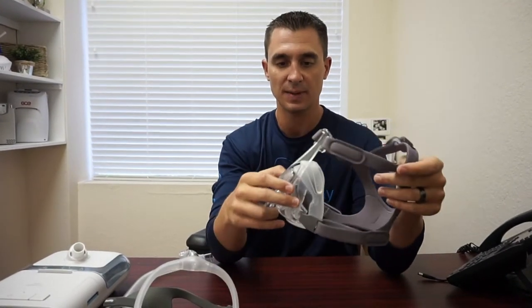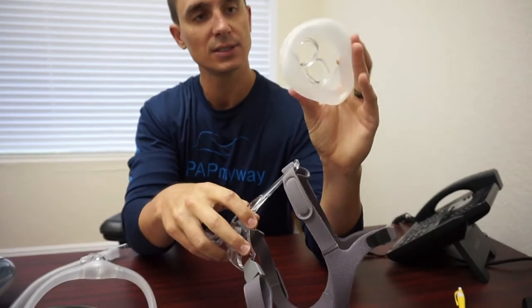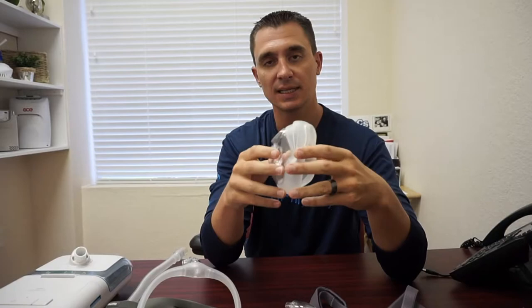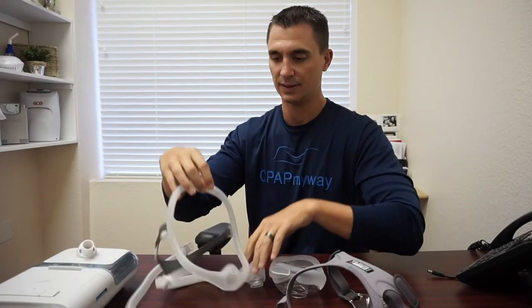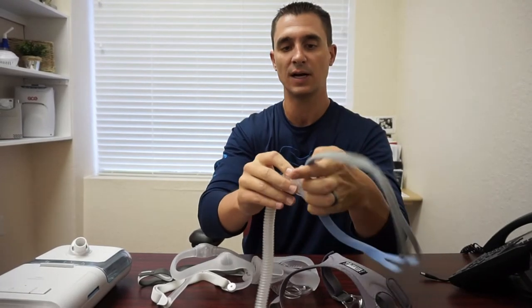Moving on, we've got the Simplus full face mask. Same general concept — headgear, obviously a little bit more of it on here, and then you've got that replacement cushion or seal. This can be washed once a week; it's best to take it out to wash it so you can get in all the little folds. As with all the rest, it's best to change it at least once a month. All of them also have a frame associated with them. The frame of the mask, as long as it's performing and doesn't have any holes in the tubing or cracks, it'll last for a very long time. I've seen some people get well over a year out of a frame just by changing out the cushions and the headgear, which saves you money if you're able to just buy the parts as opposed to buying the frame and everything all together.